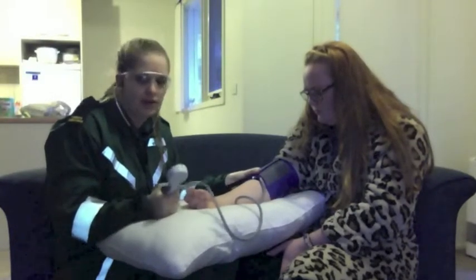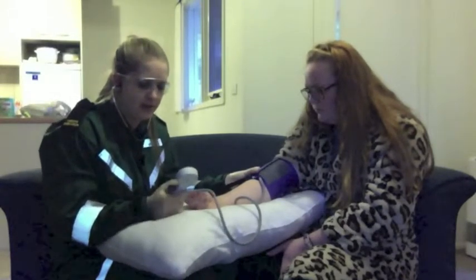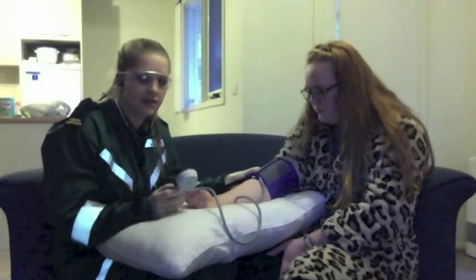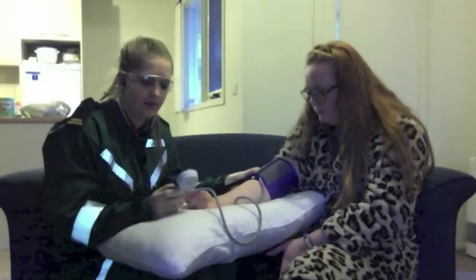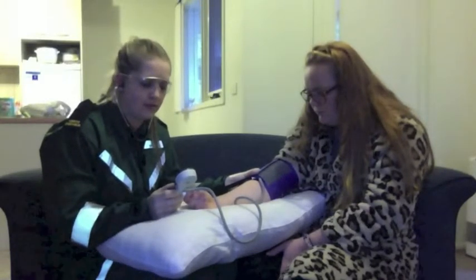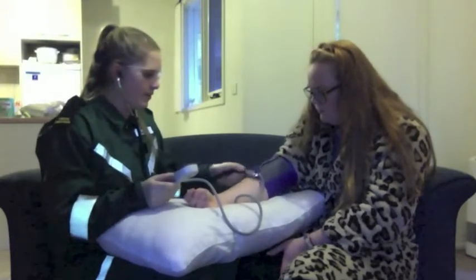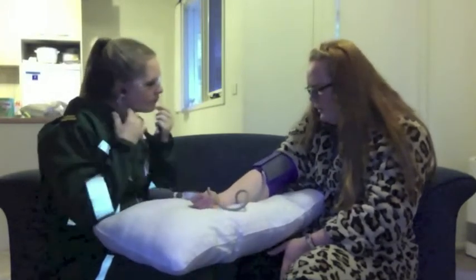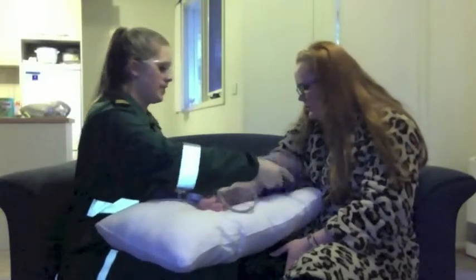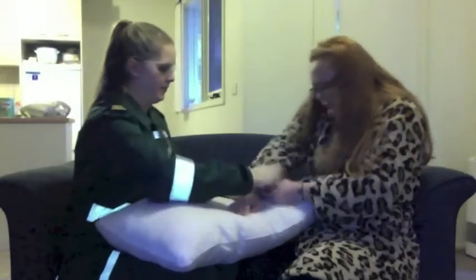And then I'm slowly going to release the cuff until I can hear a slight tapping noise, and this is the systolic number. And then I'm going to continue to listen until I cannot hear this noise anymore, which will give me Mrs. Jones's diastolic. Good, Mrs. Jones, okay? So we'll take this off now. Was everything okay? Yeah, that was fine. So that wasn't too bad. So pull this back down, it's a bit cold.